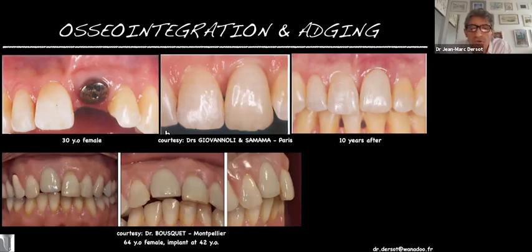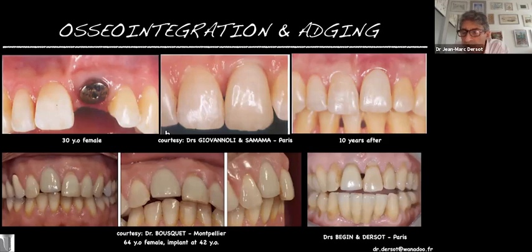Here we are 22 years after. The implant was inserted when the lady was 42, and now she is 64. So 22 years after. And the latest one, I treated this patient, a male patient, with one of my teachers, and I put an implant on the T11. As you can see, 10 years after, there is a vertical discrepancy.